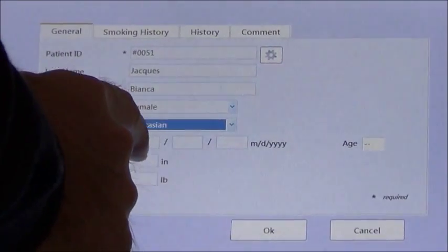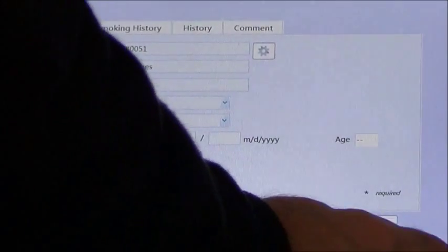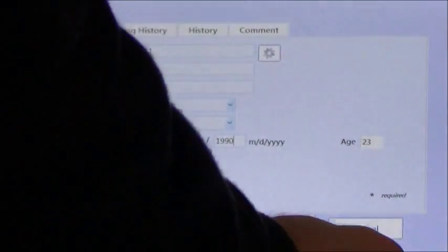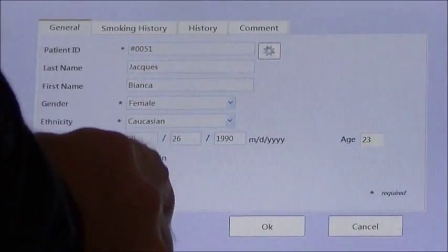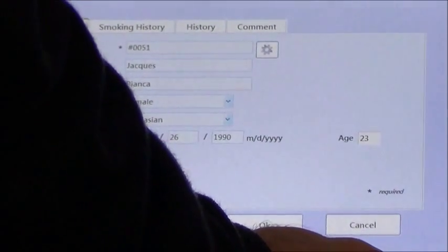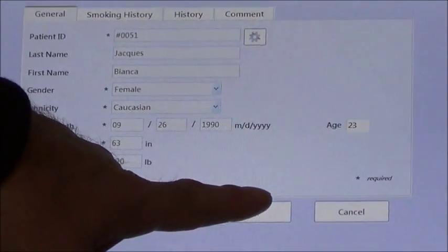So I'm going to enter that information as well. Date of birth: the 26th, 1990. And the height in inches: 63. And the weight: 120. That confirms the age there, as you can see, so I'm going to say okay here.